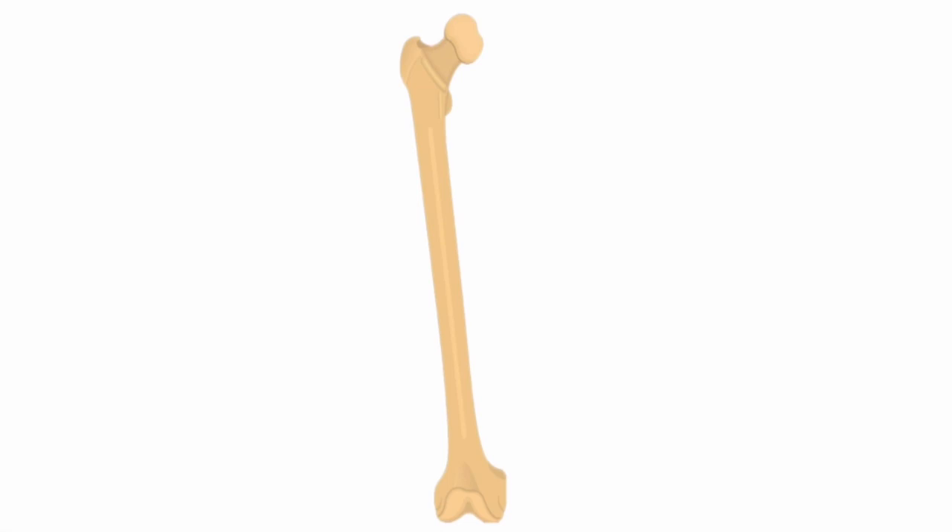The ideal position of the distal femur traction pin is just proximal to the adductor tubercle, right here. We put it from medial to lateral direction because the neurovascular structures are medial. In the tibia, however, we put it in the lateral to medial direction.